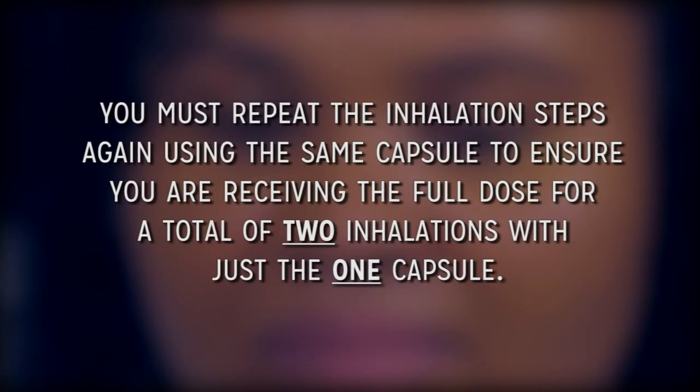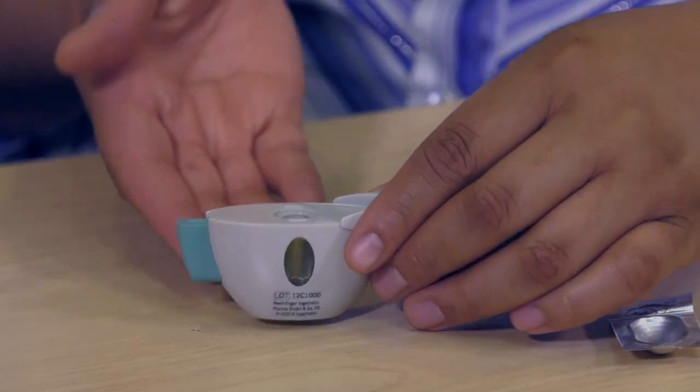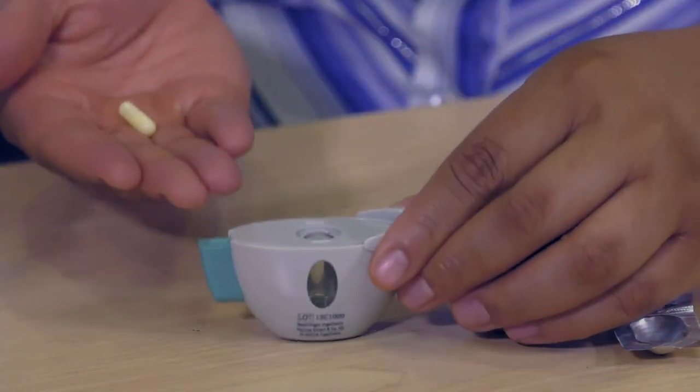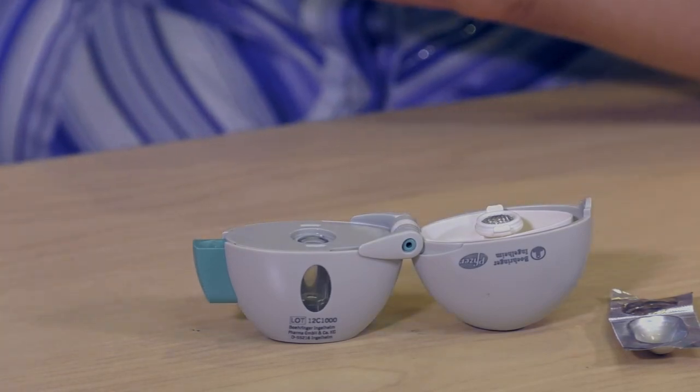You must repeat the inhalation steps again using the same capsule to ensure you are receiving the full dose, for a total of two inhalations with just one capsule. After you have finished taking your daily dose, open the mouthpiece again, tip out the used capsule and discard. Close the mouthpiece and dust cap for storage of the inhaler.